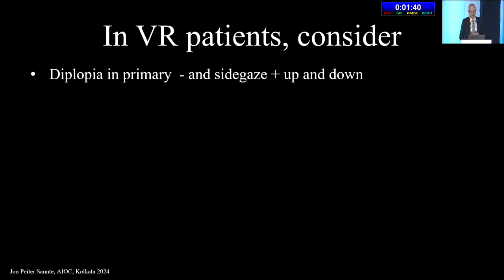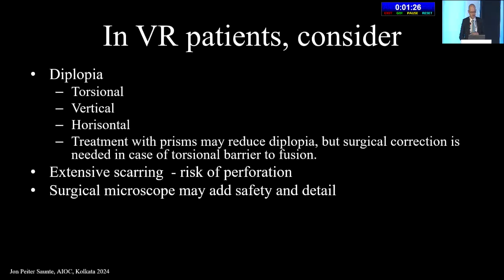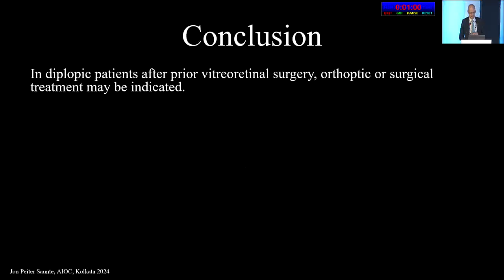detachment patients. So in patients who had strabismus surgery, who had retinal detachment surgery done before, diplopia in primary and side gaze and up and down, they can have all kinds of problems. We can treat this with prisms, but often if there's torsional diplopia, we need to take care of this with surgery. The scarring is a challenge. There's a risk of perforation of the eye, and we always use a microscope to be sure we have the detail we need. And if the silicone buckle is protruding, we remove it, but usually we leave it in place.